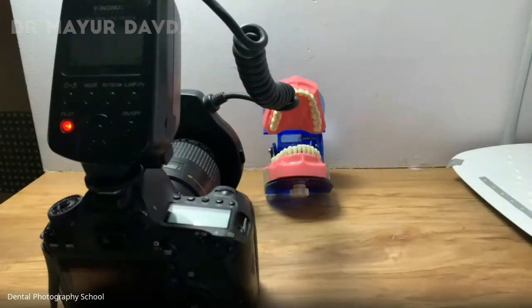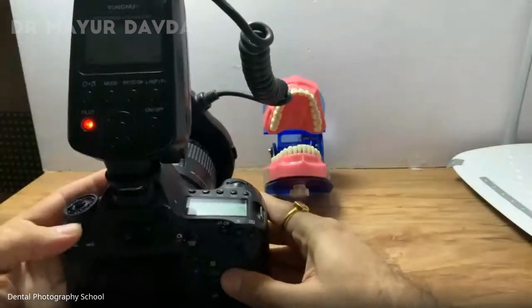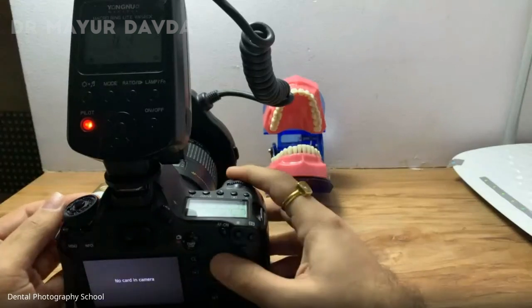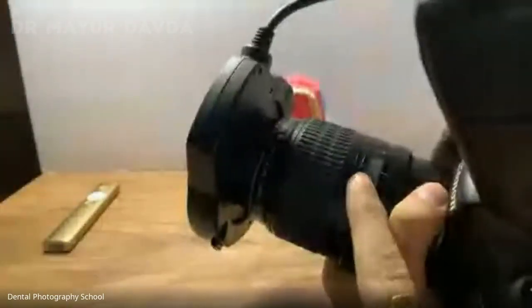Vishal Kumar has said yes, I can use it. Can you tell me why? Anybody who was saying no, can you tell me why? Because the distance is constant. That is, I cannot use my focusing ring to focus because my magnification ratio will change. At any point of time, I do not want my magnification ratio to change.